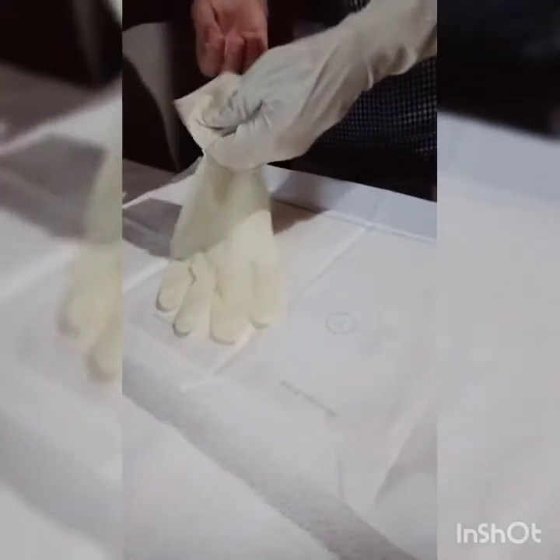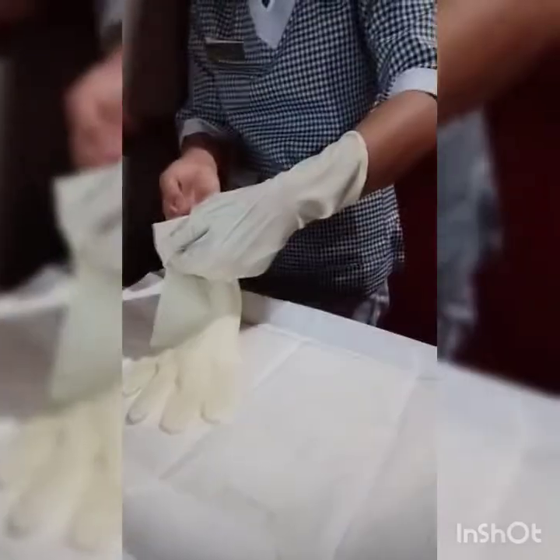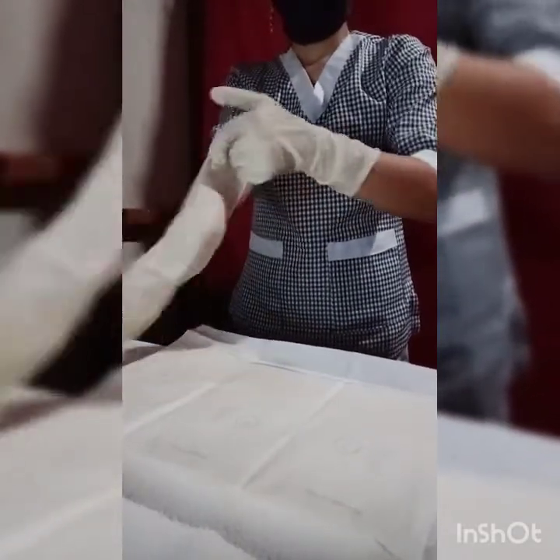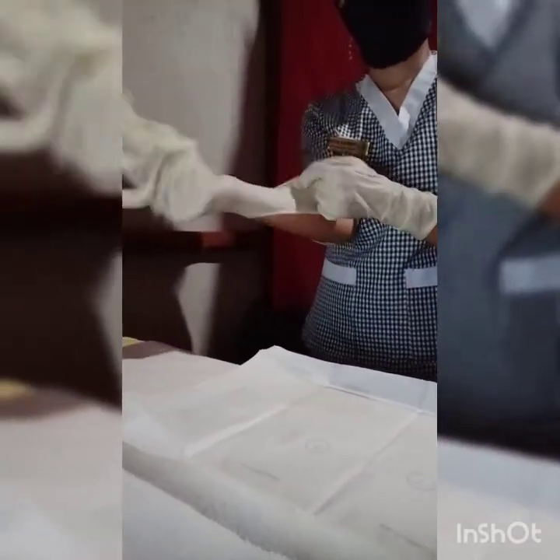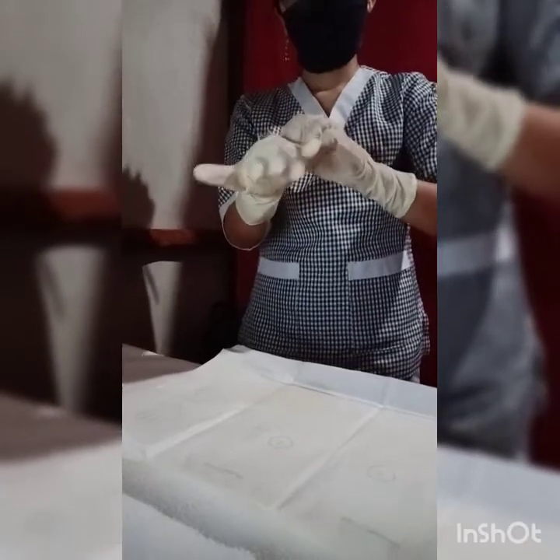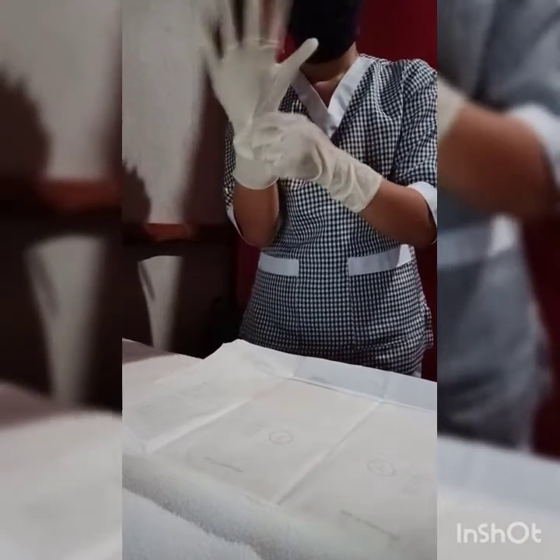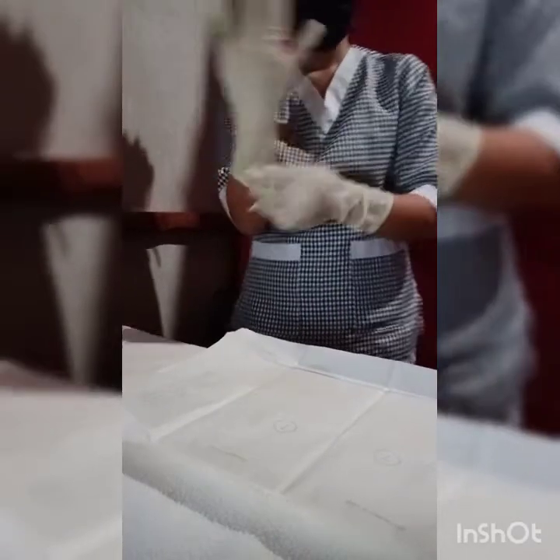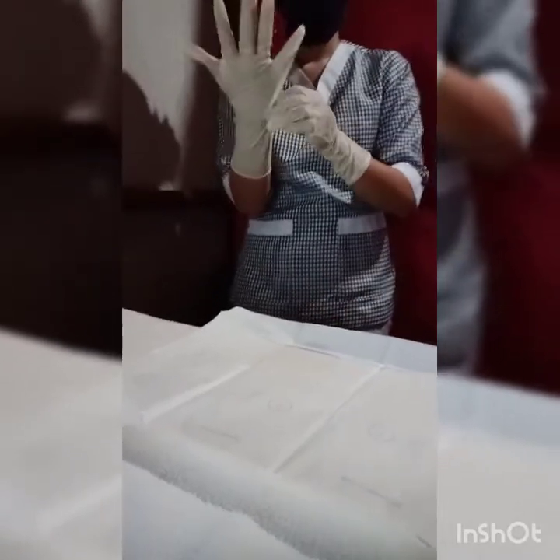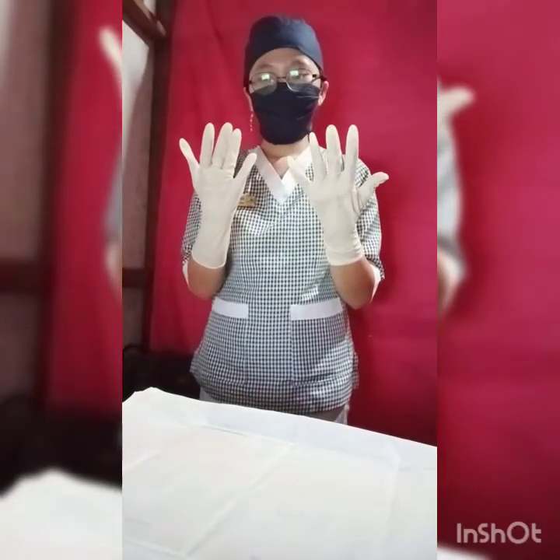Then put the second glove on the non-dominant hand. Pick up the other glove with the sterile gloved hand, inserting the glove fingers under the cuff and holding the glove thumb close to the glove palm. So pull on the second glove carefully, then hold the thumb of the gloved first hand as far as possible from the palm. Then adjust each glove so that it fits smoothly and carefully pull the cuffs up by sliding fingers under the cuffs. So we're done with open gloving.